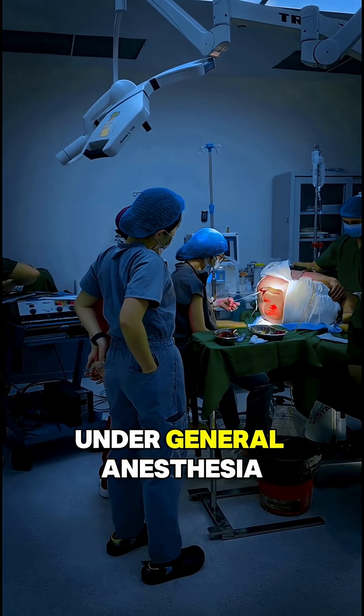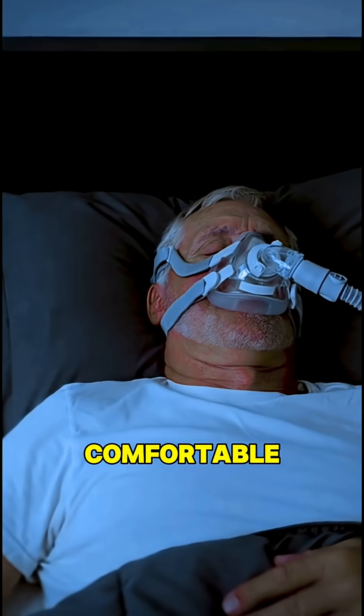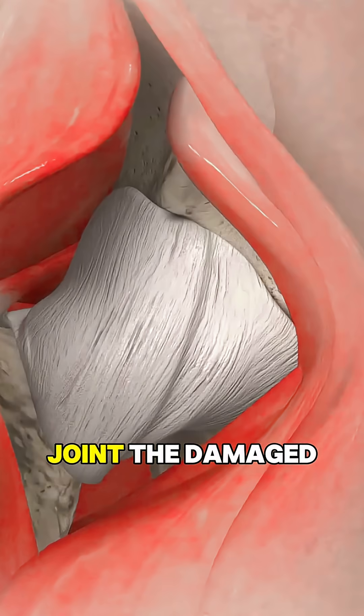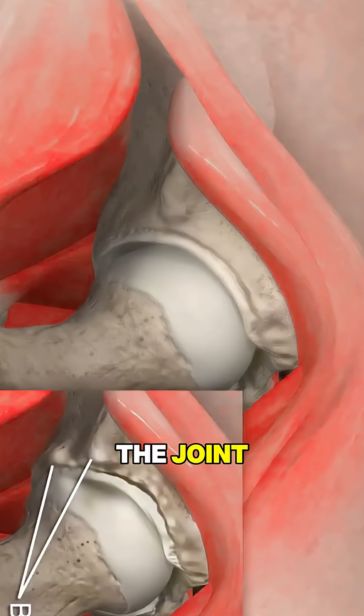The procedure starts under general anesthesia, so you stay comfortable. The surgeon makes an incision along the side or front of the hip to access the joint. The damaged femoral head, which is the ball part of the joint, is carefully removed.